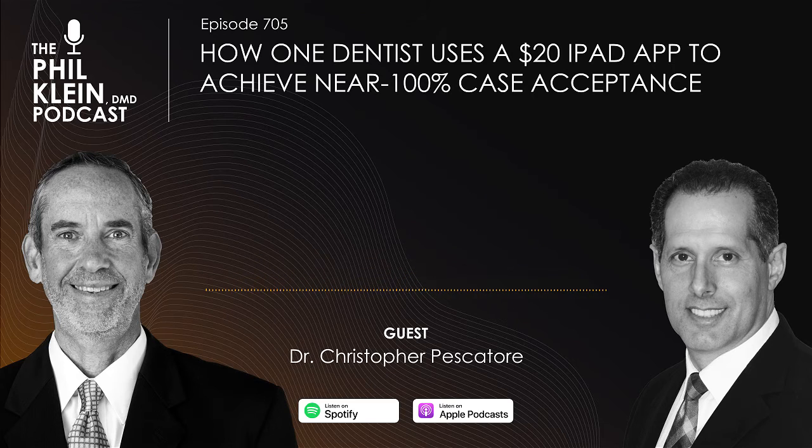It is to just help with the rapport and the patient education and all that. And those are almost the more valuable things to me. I mean, there's nothing wrong with impressions; people are so against them. I think impressions are fine. For all my big digital cases, of course I scan them, but I still take an impression, because to me, impressions are your backup.